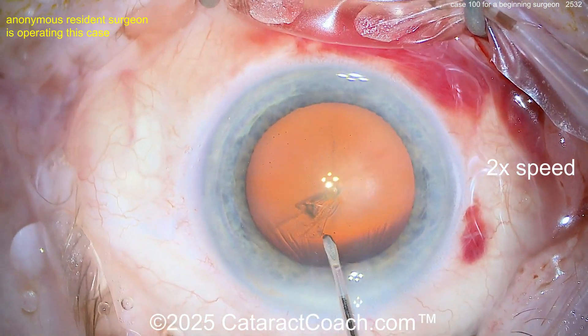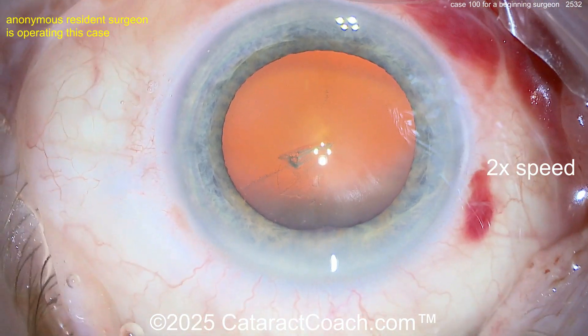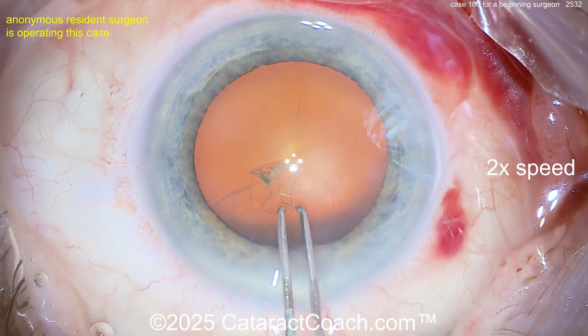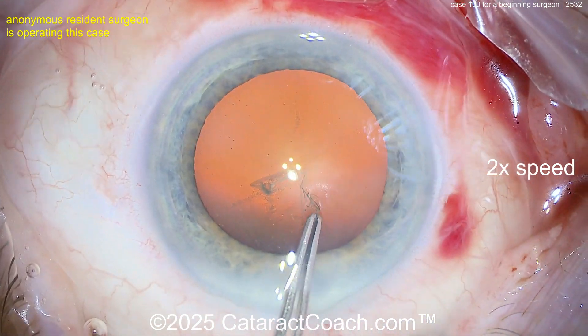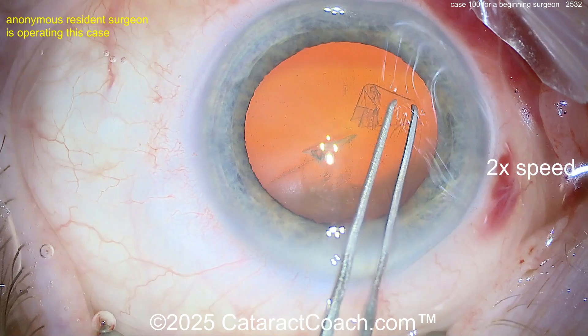Now starting off the rhexis here — pulling, okay. The goal is obviously a five to five-and-a-half millimeter rhexis. The eye is nicely positioned in primary — I like that. Grabbing with the forceps, bringing this around. Be careful of those danger zones — you better go to cataractcoach.com and look that up.